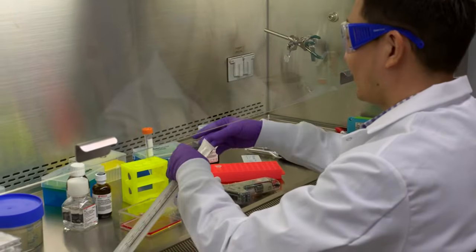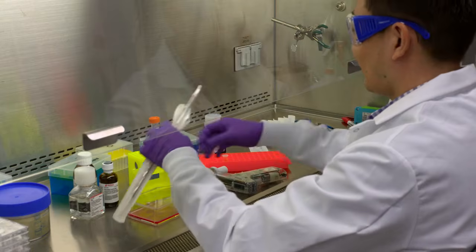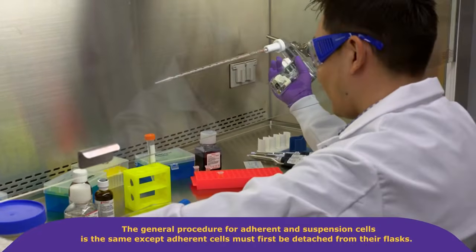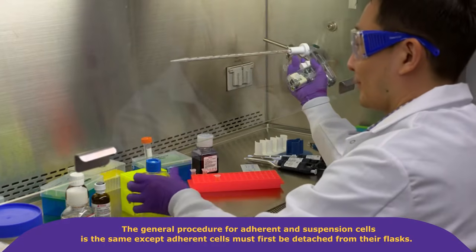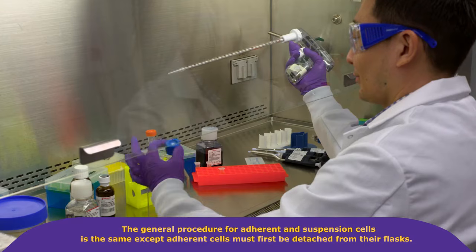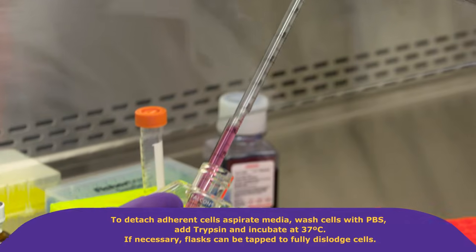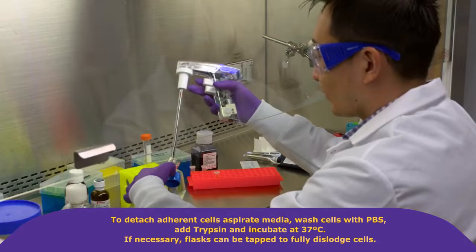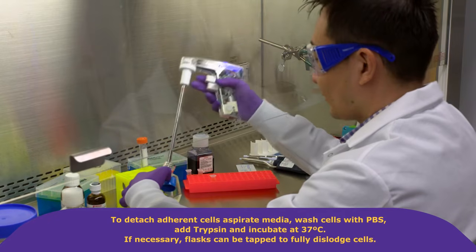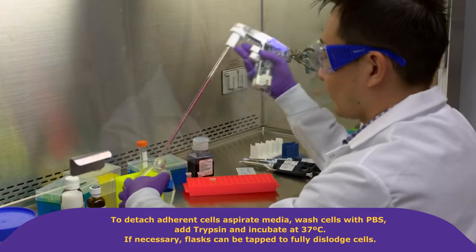For best results, cells should be growing in exponential phase and not overly crowded or confluent. The general procedure for adherent and suspension cells is the same, except adherent cells must first be detached from their flask. To do this, aspirate media, wash cells with PBS, add trypsin, and incubate at 37 degrees Celsius to detach. If necessary, the flask can be tapped to fully dislodge cells.